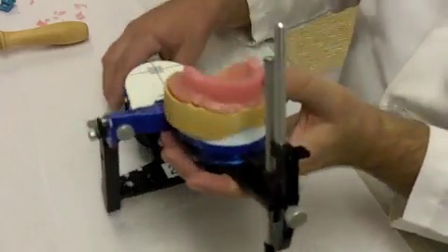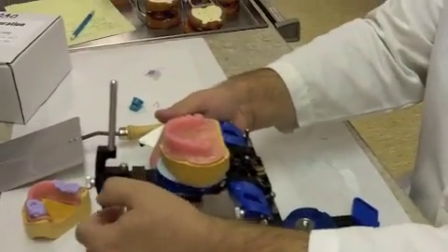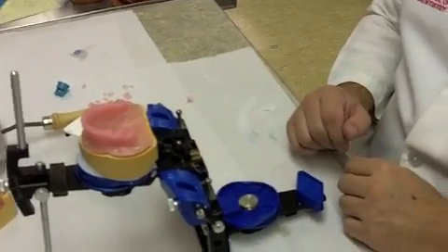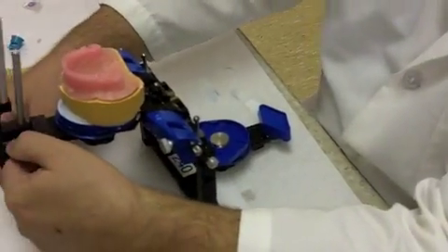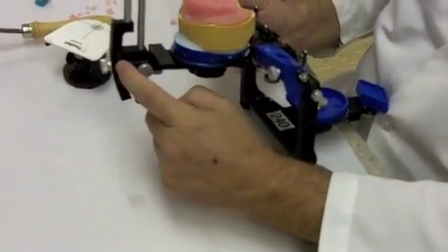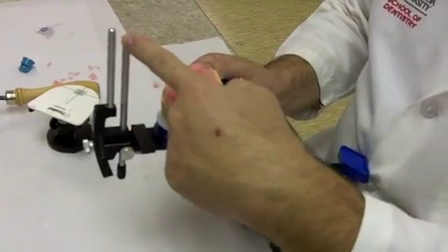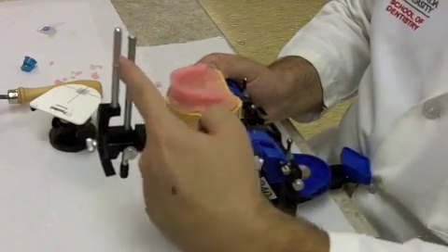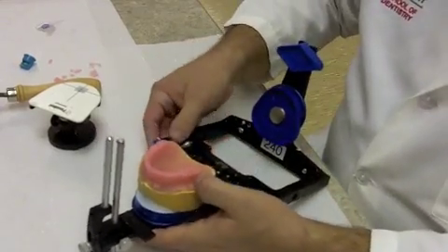So once you get that cleaned up and looking nice, then you want to take off the table. You want to make sure that you have a new mounting plate on the mandibular arch. And the key here is that second pin. That second pin, I often see students having it too high and it interfering with the pin that's set at 0 touching the table. So you can see here how I've set that inner pin just slightly lower than the outer pin that's actually set at 0.